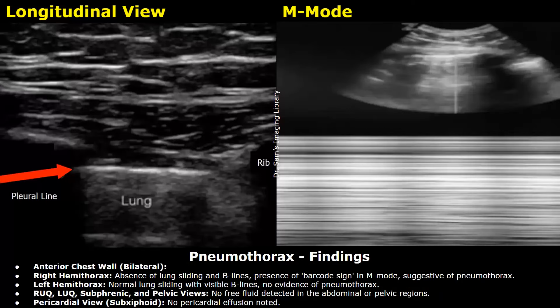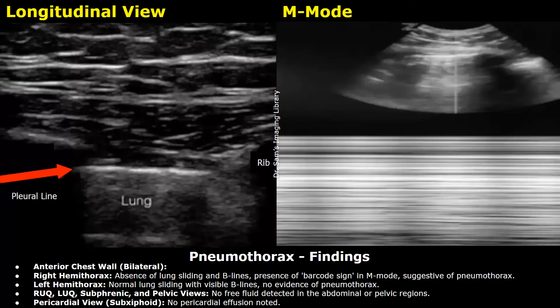Findings — Anterior chest wall, bilateral. Right hemithorax: absence of lung sliding and B-lines; presence of barcode sign in M-mode, suggestive of pneumothorax. The barcode sign is seen in M-mode in pneumothorax. Left hemithorax: normal lung sliding with visible B-lines, no evidence of pneumothorax. Other views were all normal.